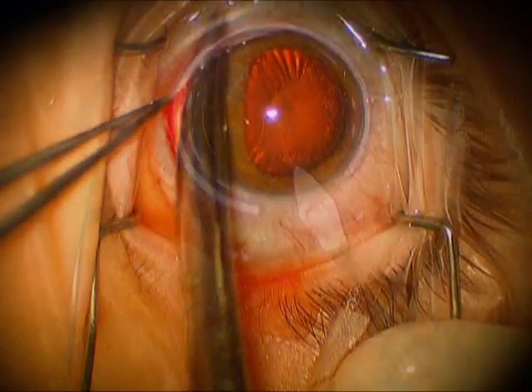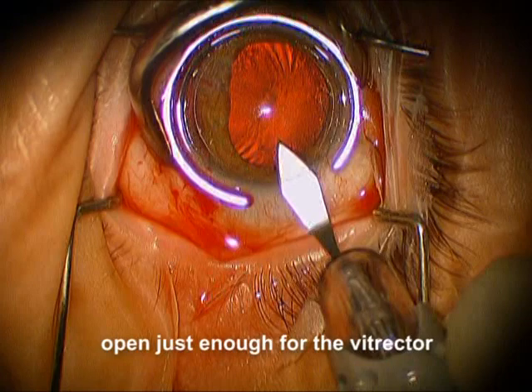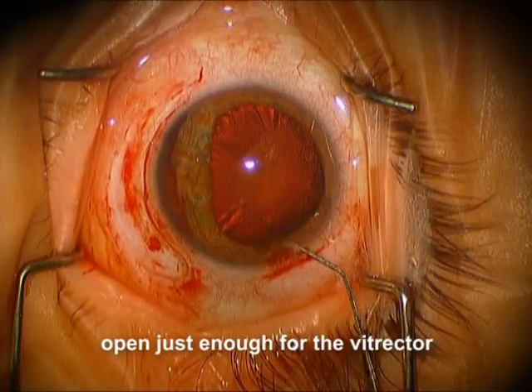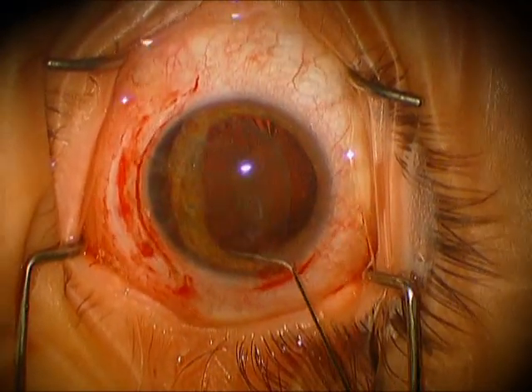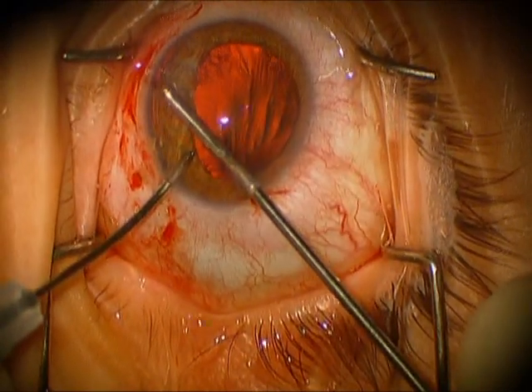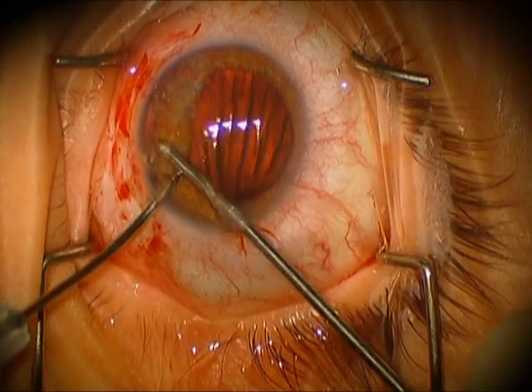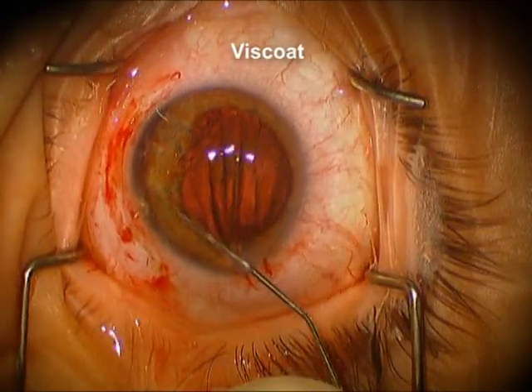We're doing a peritomy in the area of the iridodialysis. We're first using the keratome, just partially going in, just enough so that we can later use the anterior vitrector here. We use some non-preserved Kenalog, and we're doing the anterior vitrectomy here in the area where some vitreous is coming around with loose zonules.